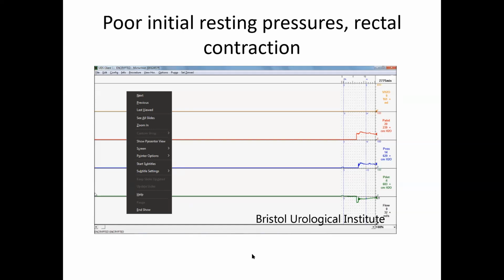Who hasn't answered? Flush it. Fantastic. Okay, so this chat box does work. You would flush it. So you flush to either remove an air bubble, to buy you a bit of time, to work out why that line isn't working properly. Once you've flushed it, what would we then do to check that it's actually working? Cough. Brilliant.